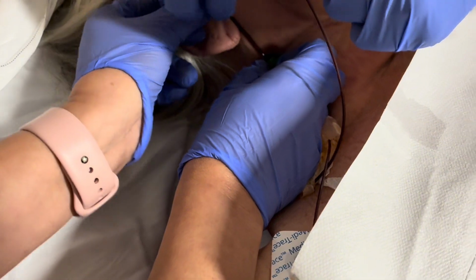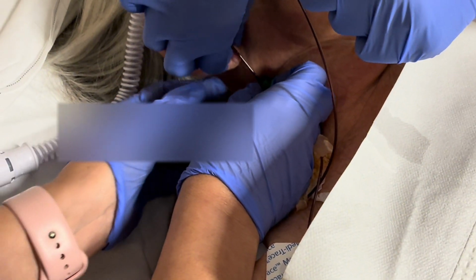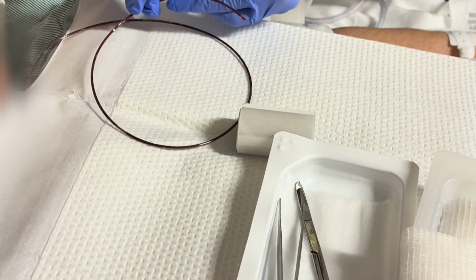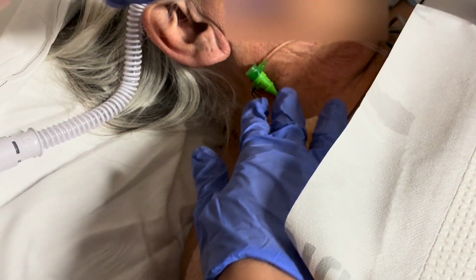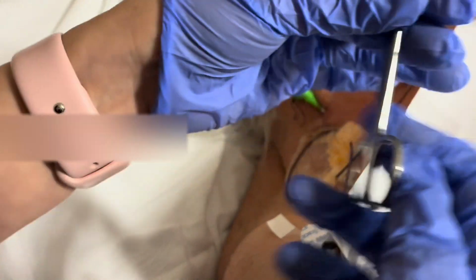There you go. And yeah, good job, Asha. All right, so that's the tip. You want to make sure that the tip of the catheter is also intact, right? So what we have left here is the cordis or the sheath. This is actually just where they introduced the EKOS catheter, right? So we could actually take this out now.